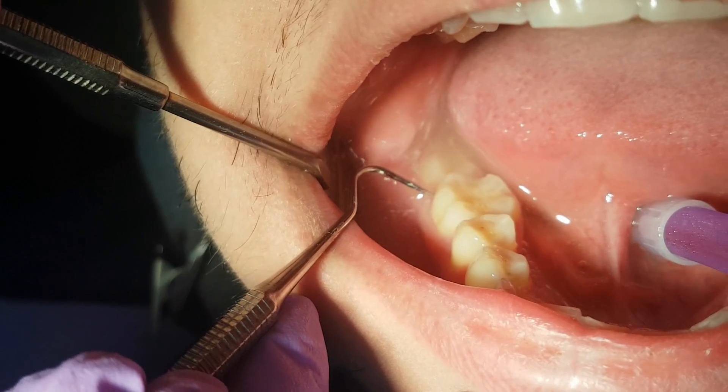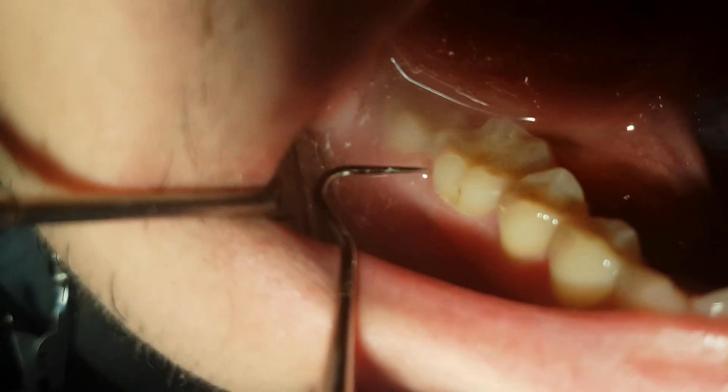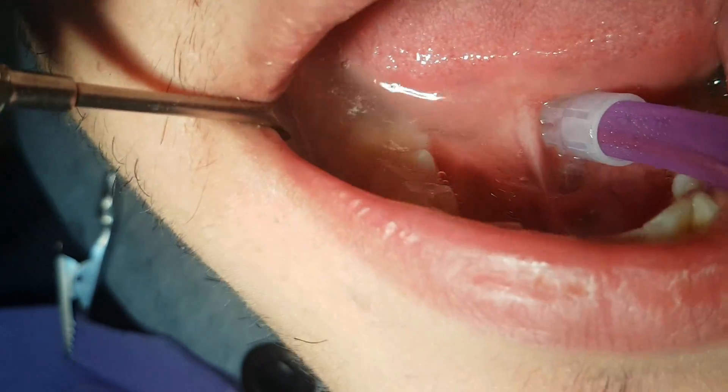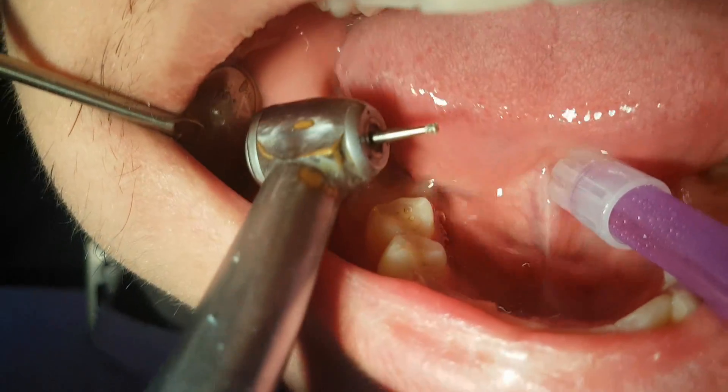Right next to it we have a restoration by sixth class of Black classification and atypical caries. We will treat this caries separately so we preserve the structure of the tooth.